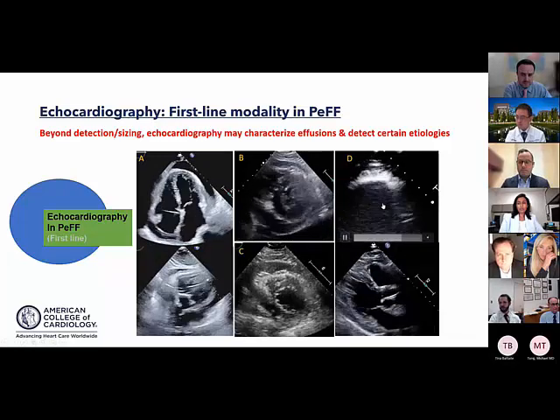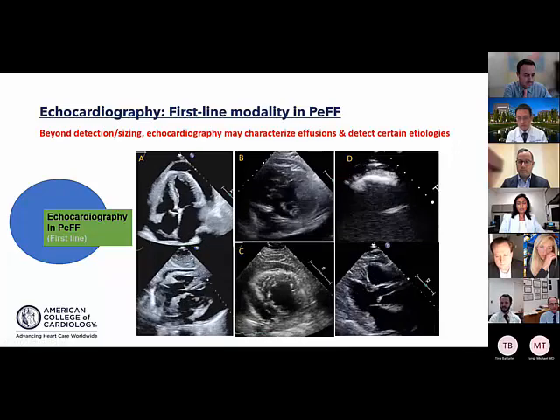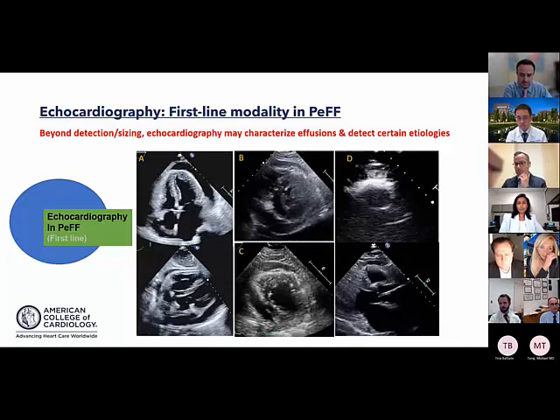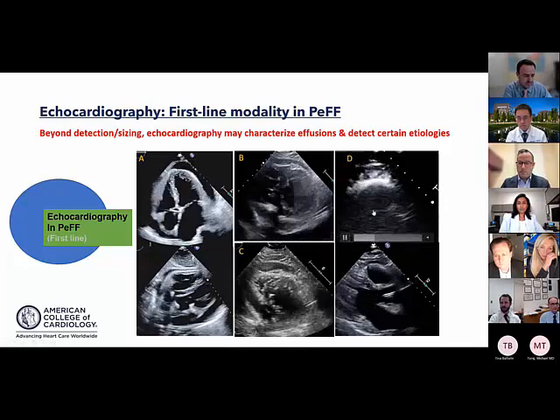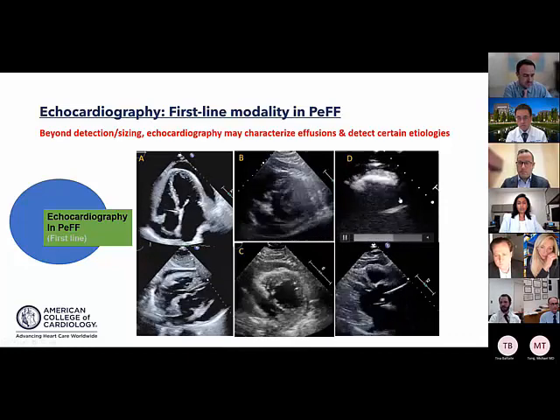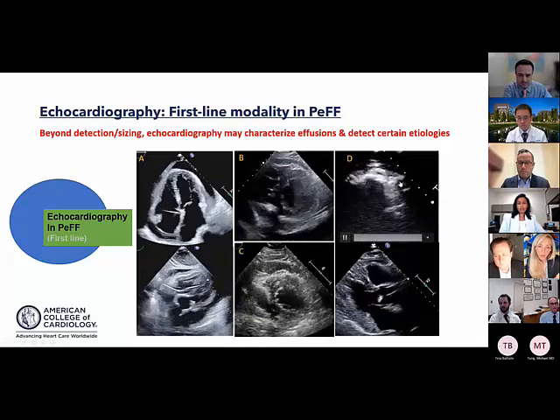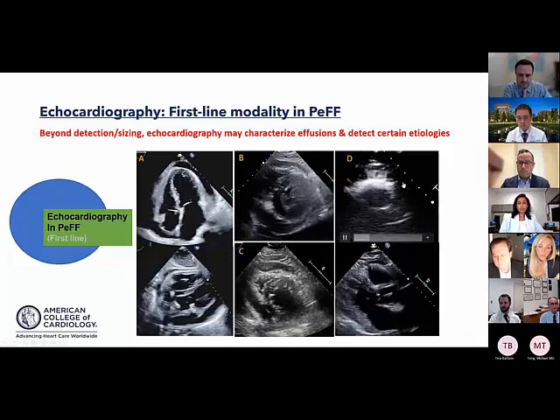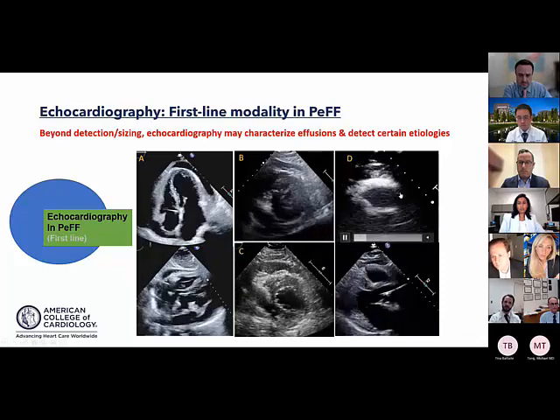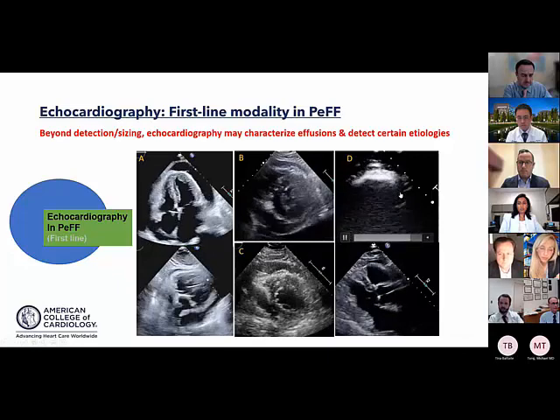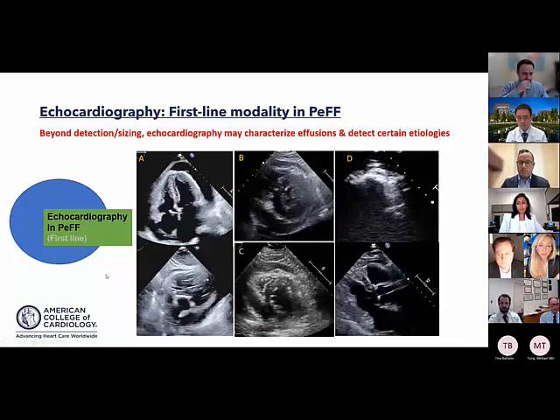A patient imaged in the cath lab after decompensation, with injection of echo-enhancing agents, shows clear extravasation into the pericardium — another tool in our toolkit to evaluate effusion beyond detection and sizing.